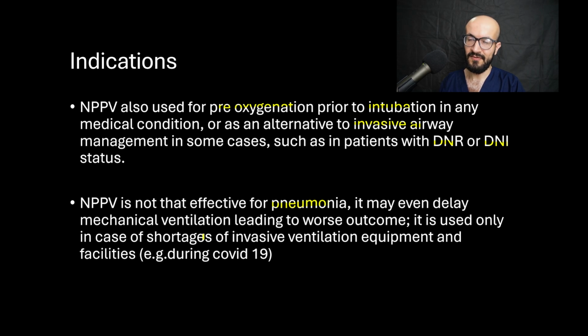It may even delay mechanical ventilation, leading to worse outcomes. And it is used only in case of shortages of invasive ventilation equipment and facilities, such as what happened during COVID-19, so it would be an alternative to invasive ventilation.